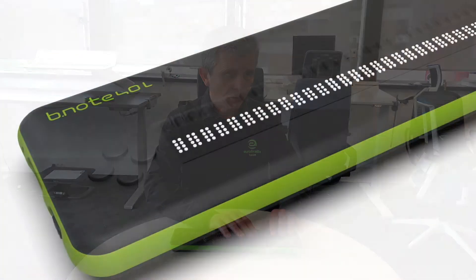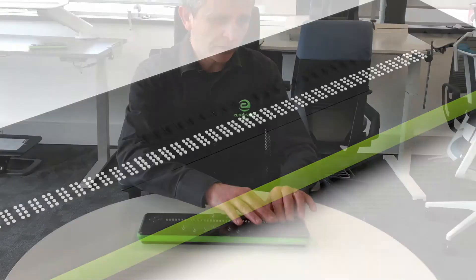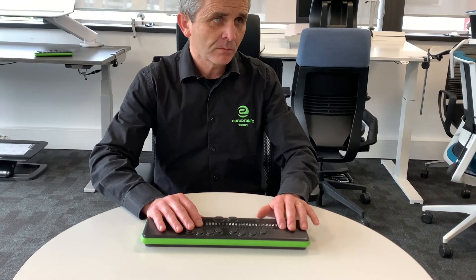Most importantly, we have developed a new routing cursor key system which consists of using a double-click function on the routing cursor keys. A light click on any routing cursor key triggers the first contact, and a stronger click will trigger the second contact.